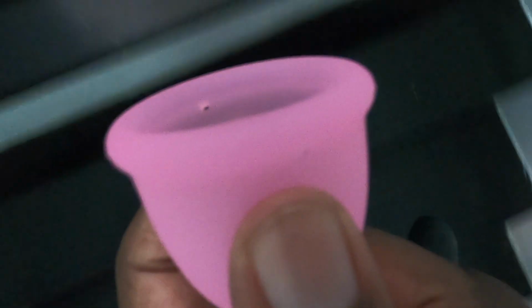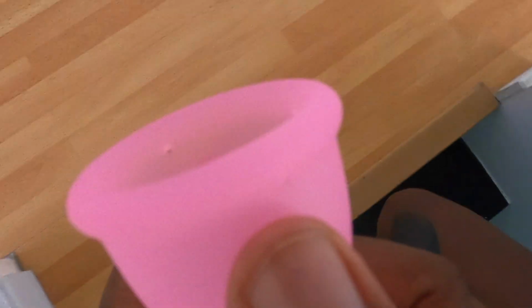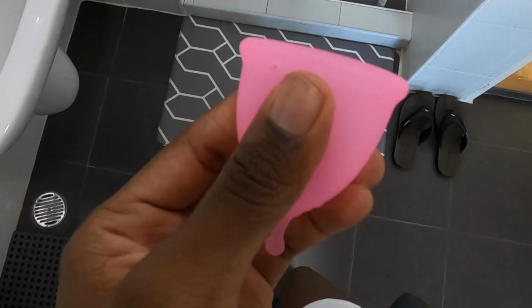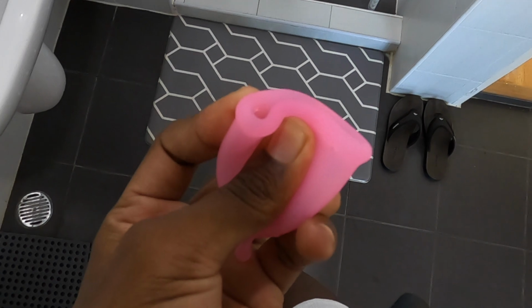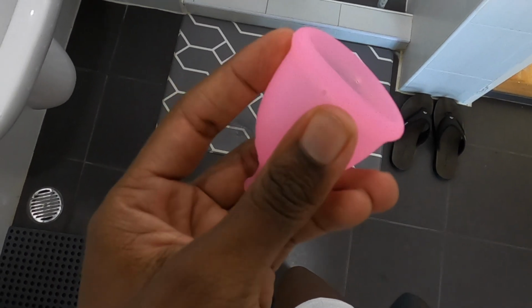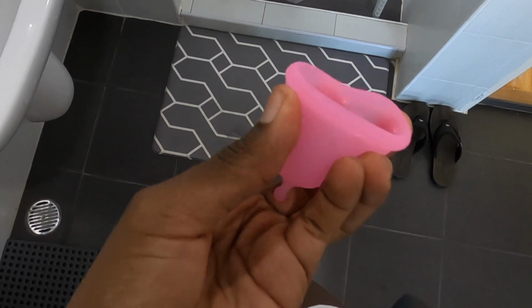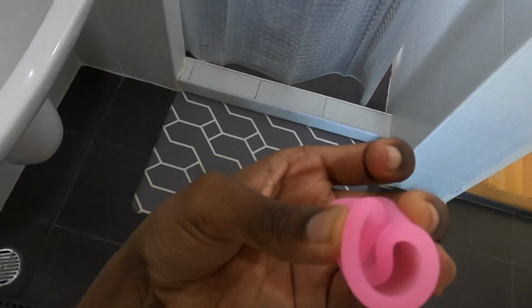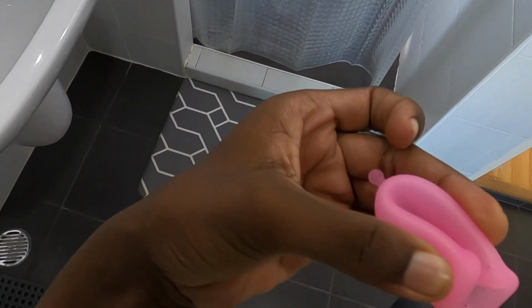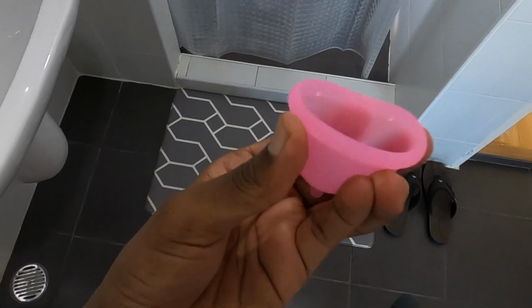Okay, now I'm going to the bathroom to insert it, guys. This is exciting and at the same time scary. Okay guys, they say that you have to fold it like a U. Like that. Let me try it again. Yes, like this, and then you insert it. I'm not going to show you guys how I do it, but let me do it, then I'll tell you how I feel after I insert it.